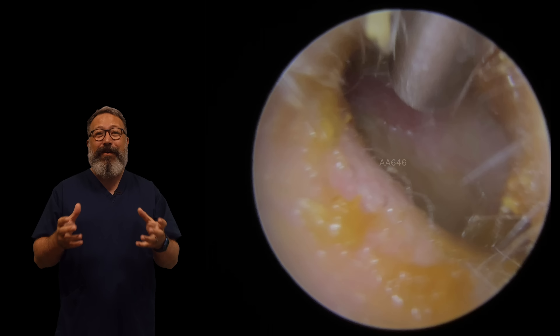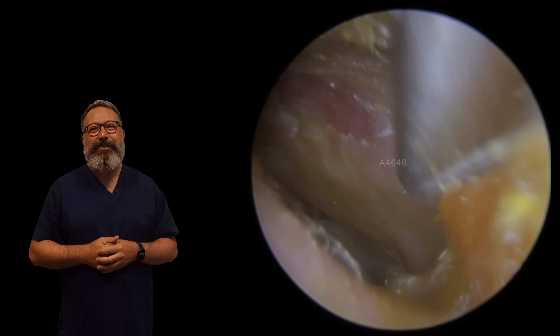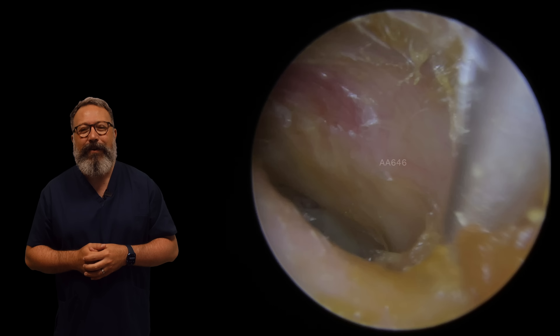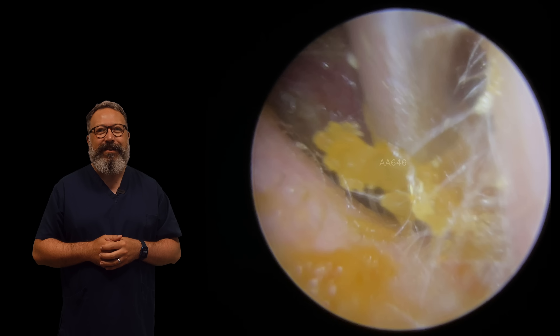The whole thing almost came out in one big piece. So we're just going to tidy up around the outside edge - a little bit of hoovering up. Just get rid of these little pieces, go around the outside edge.